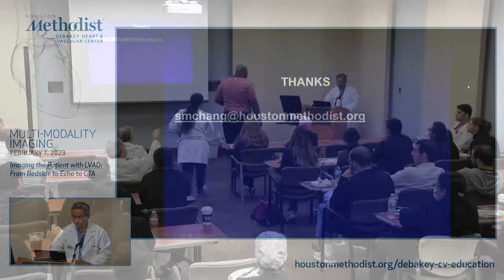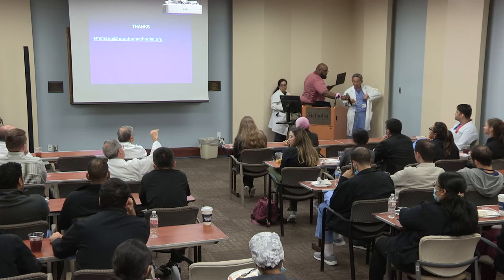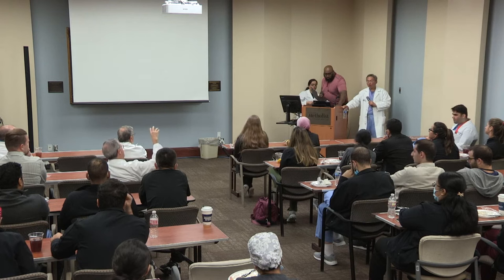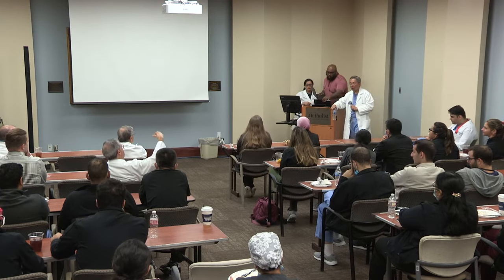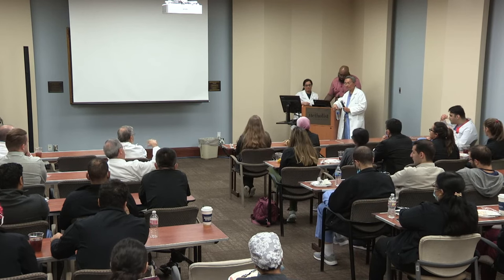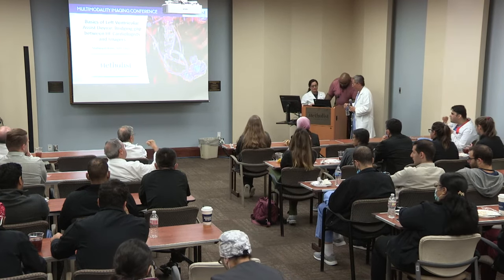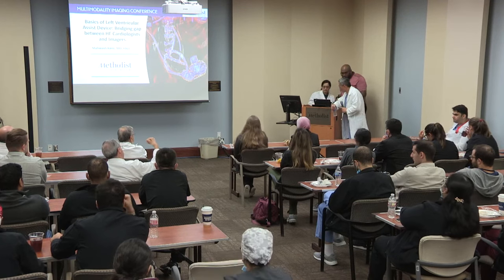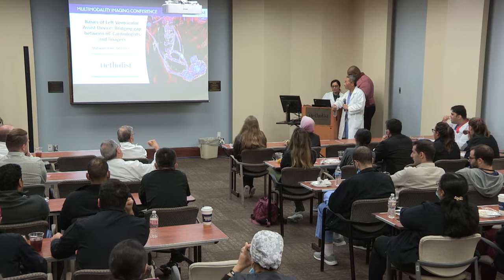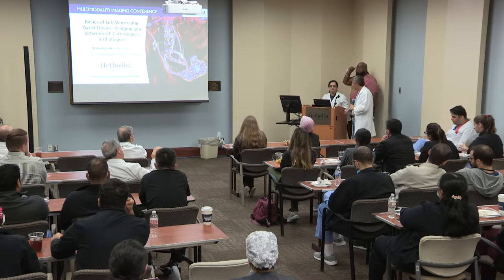Yeah. So we've been told at times that these positional problems with cannulas, particularly the inflow cannula, happen because, quote unquote, that's the best the surgeon can do at the time of implantation. So the patient is stuck with it because that's the best the surgeon could do. My question to you is, is there any pre-LVAD imaging that could be done to help the surgeon plan it and hopefully have fewer of those best-I-could-do outcomes, which leave the patient in a bad position at the time?